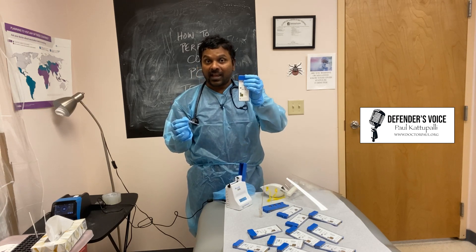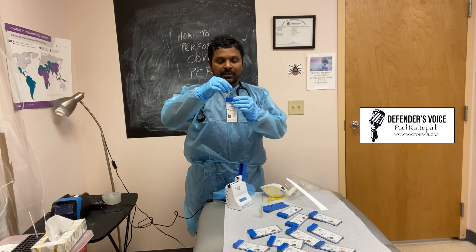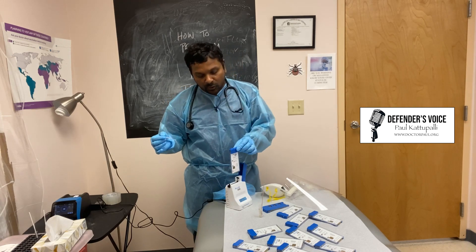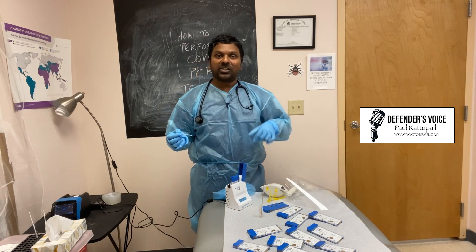This is the cassette. You put the solution into this cassette, and then this goes into the machine. Then the machine starts.